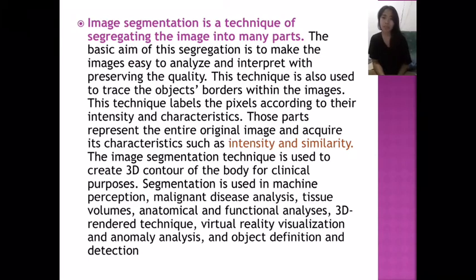The image segmentation technique is used to create a 3D contour of the body for clinical purposes. Segmentation is used in machine perception, malignant diseases, analysis, tissue volumes, anatomical and functional analysis, 3D rendering techniques, virtual reality visualization, anomaly analysis, and object definition and detection.